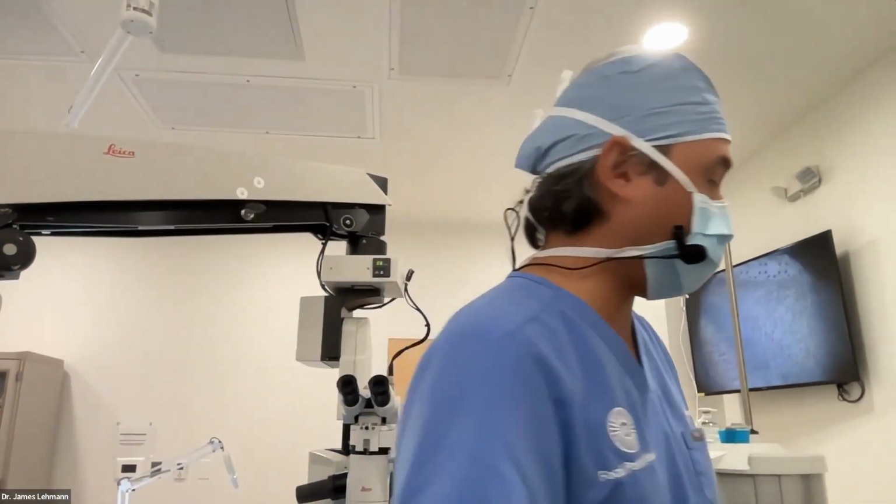So you take over for a little bit, Hunter. Yeah, thank you, Dr. Lehmann. Certainly there were a lot of great things said there. I want to remind the entire audience, there's no small steps in phaco. A lot of times people will make a really quick wound or a really quick paracentesis, and then the paracentesis leaks the entire procedure, and you've got an unstable chamber. You're constantly fighting a prior mistake.